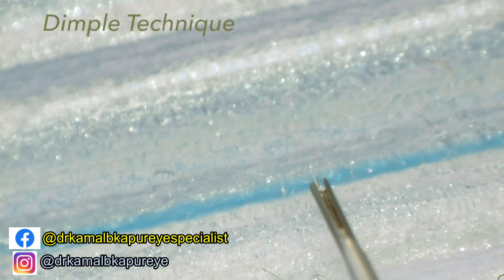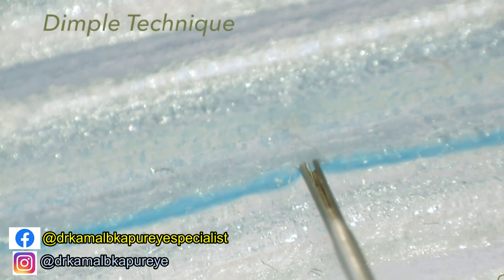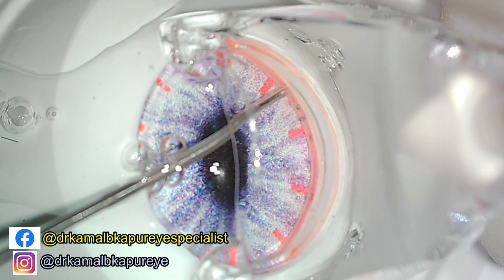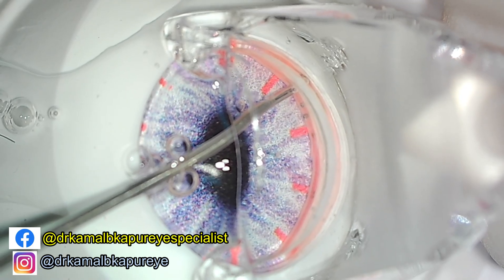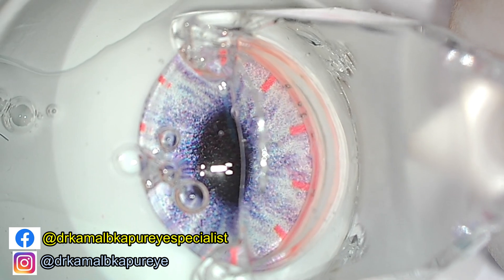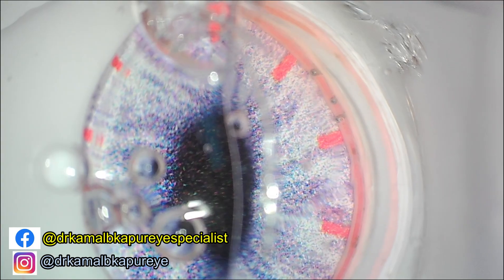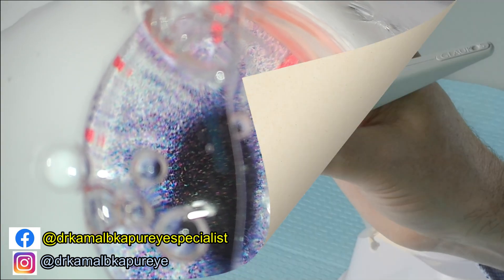The injector is inserted inside the eye and under visualization the plunger is used to create a dimple in the trabecular meshwork, and then the button for pushing the eye stent implant is pushed. You should go absolutely in a straight line without any tilt or causing any bending of the injector plunger. Here you can see three stents which have been implanted in the dummy eye trabecular meshwork.